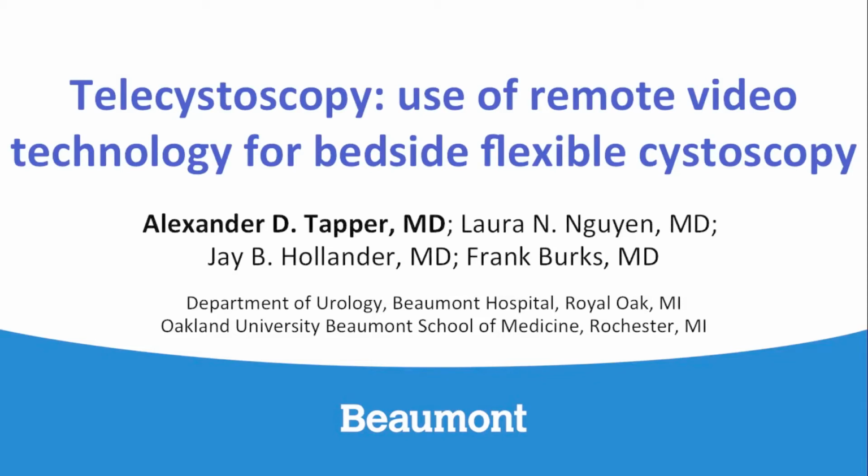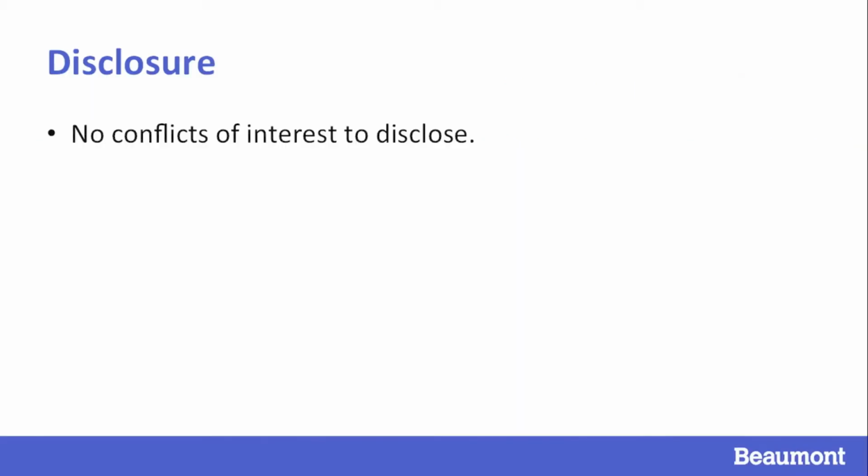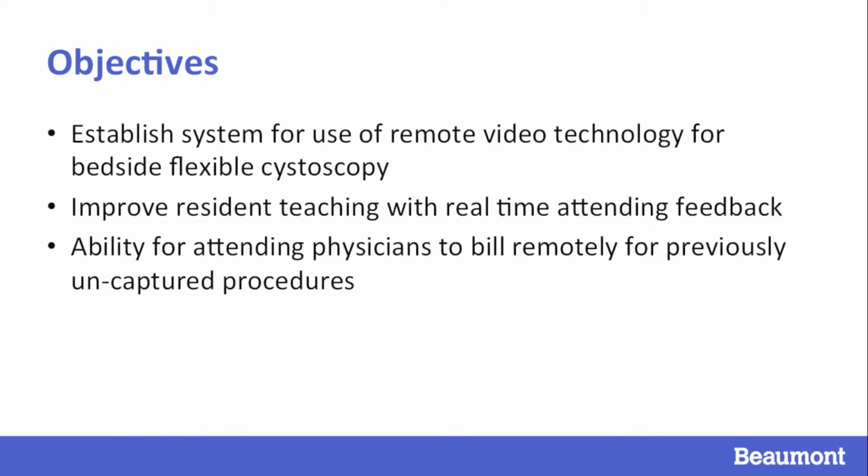Telecystoscopy. Use of remote video technology for bedside flexible cystoscopy. Our objective with this proof of concept study is to demonstrate a novel system for performance of bedside cystoscopy remotely. Additionally, we aim to improve resident training during these procedures with real-time feedback.